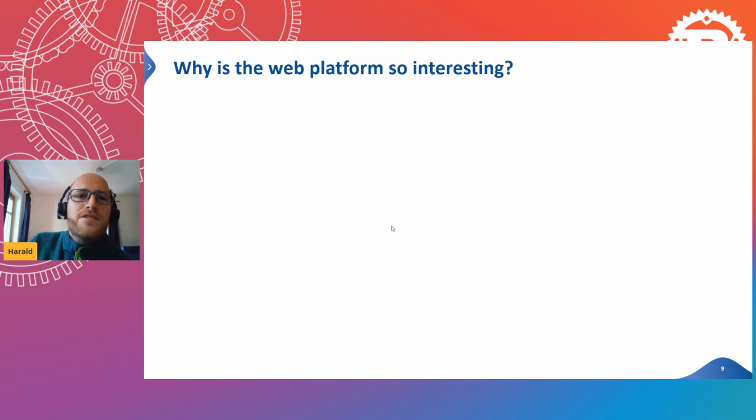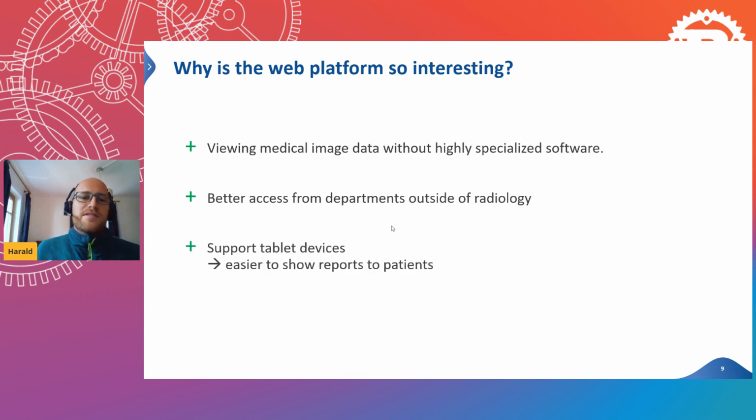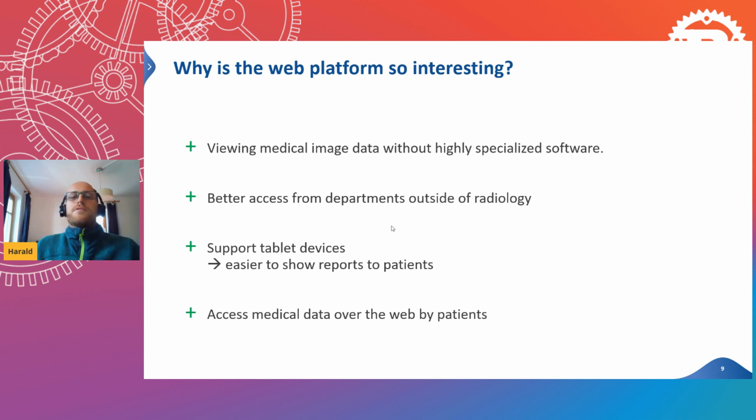And I also wanted to mention why the web platform is interesting to us. Right now you need highly specialized software to view the radiology data, but we want to get away from that. There should be better access from departments outside of radiology, which do not have this specialized software. And also we want to support tablet devices because this way it is easier to show reports to patients. And probably sooner or later access to medical data should be possible by the patients themselves over the web.